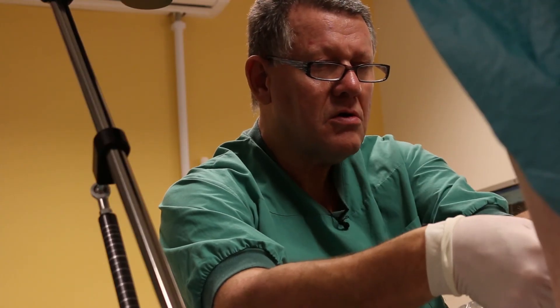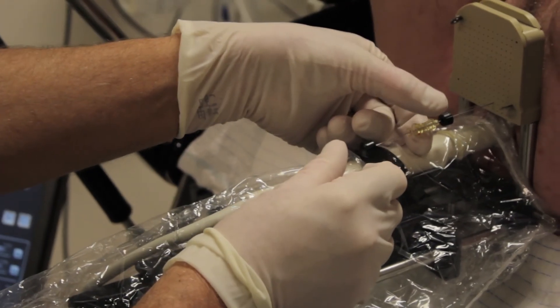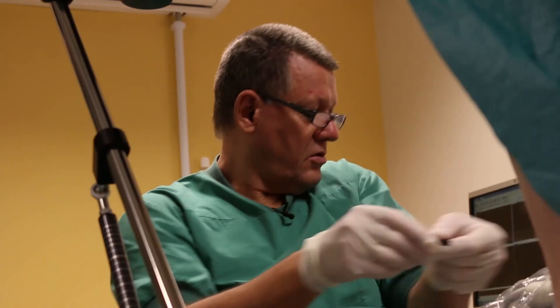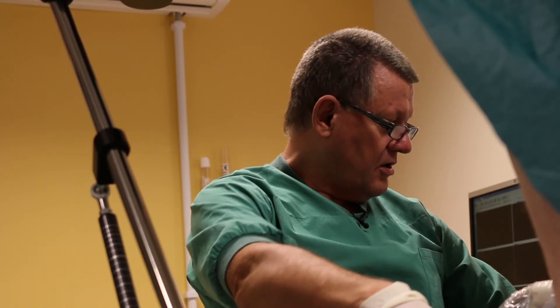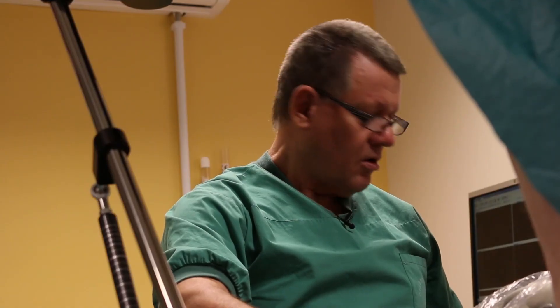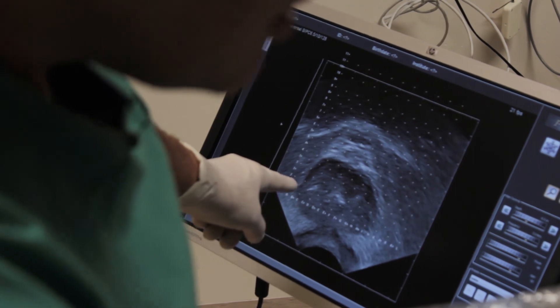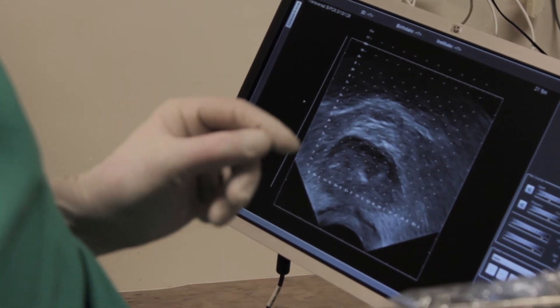I will do a point source, so I hold the needle fixated and put the obturator in like that. We can easily see that the marker is here — exactly in the equator position — and the linear source begins at that position, about four millimeters more caudal in the prostate gland.